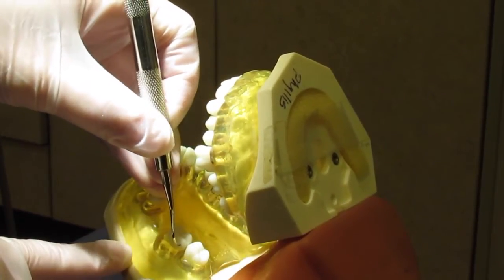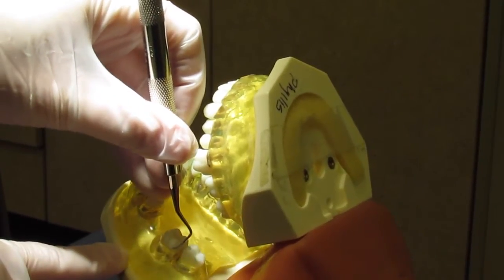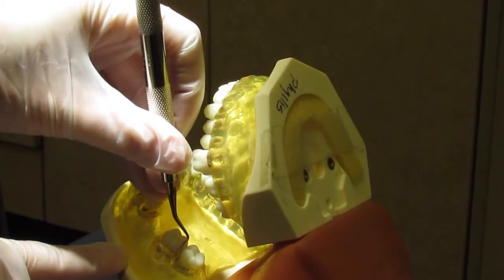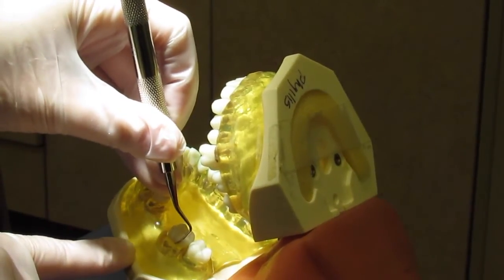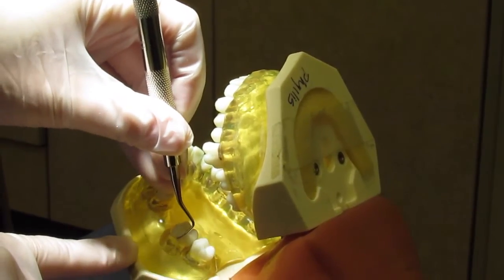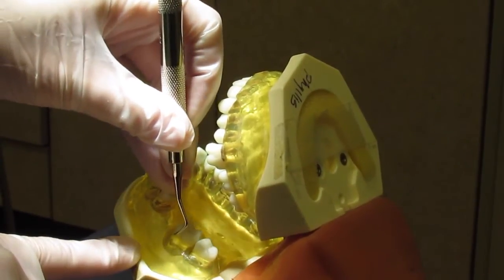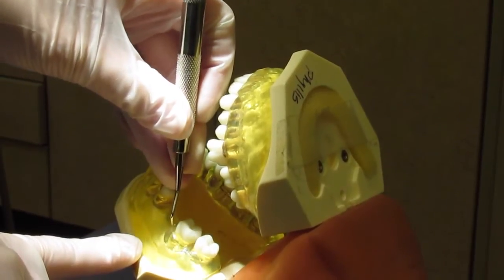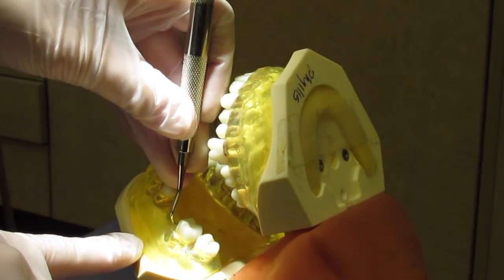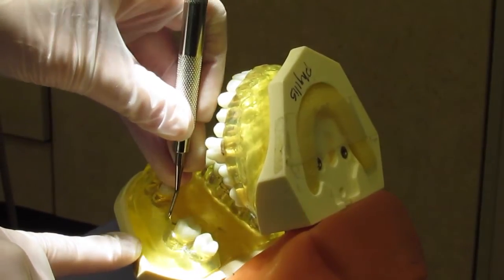Then you're going to come back out and readjust to go mesially, closing the blade to insert subgingivally, and then activate oblique strokes going mesially — nice short controlled strokes — rolling and pivoting to go mesially, and then a couple up and down strokes when you're in the mesial.